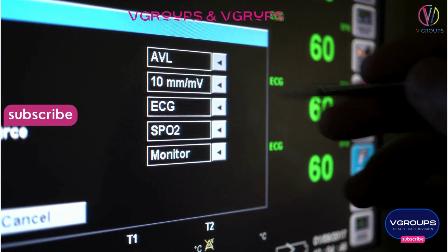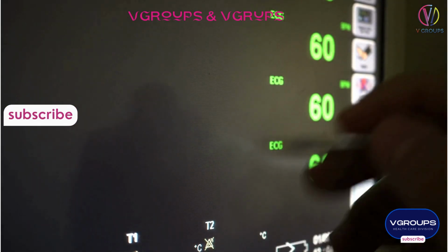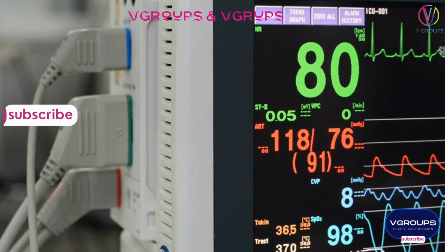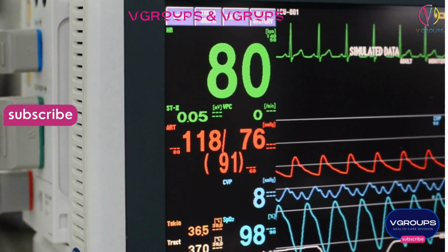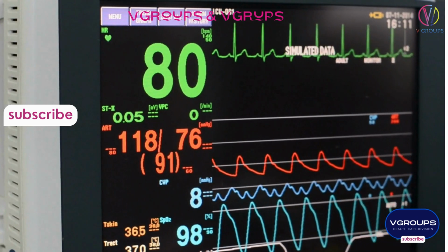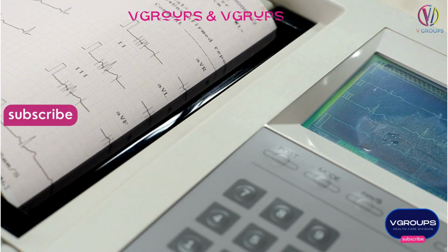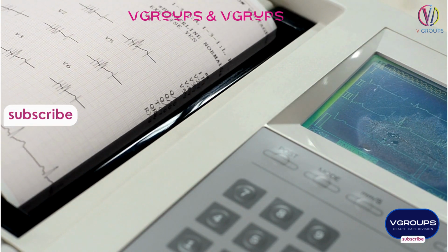Assessment of cardiac rhythm. ECG is crucial in assessing the heart's rhythm. Irregularities in rhythm, such as atrial fibrillation, can increase the risk of blood clots and stroke. Treatment and management can be initiated to reduce these risks. Risk stratification. ECG findings, along with other clinical information, help in stratifying patients into different risk categories. This aids healthcare professionals in determining appropriate preventive measures and interventions.